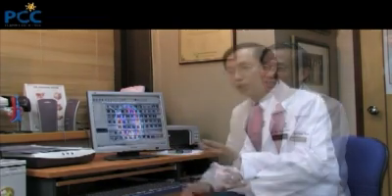This is a very good case to illustrate. It is a situation where the patient has had prior surgery and also radiation, and now through a PET scan we can in actual fact detect a tumor recurrence that is just adjacent to the surgical site. So it is very important in the follow-up of patients to consider when a PET scan may help us to follow up and establish whether the patient is indeed disease-free or has a cancer recurrence.